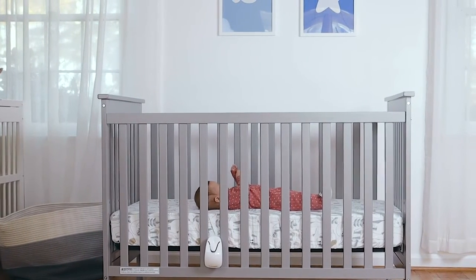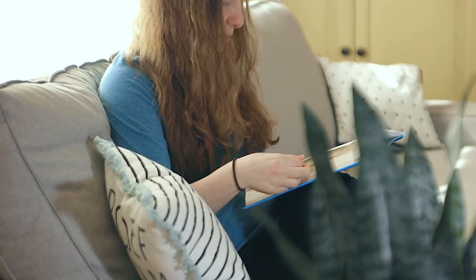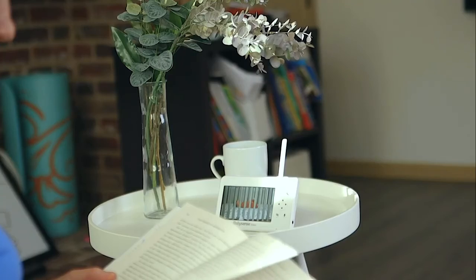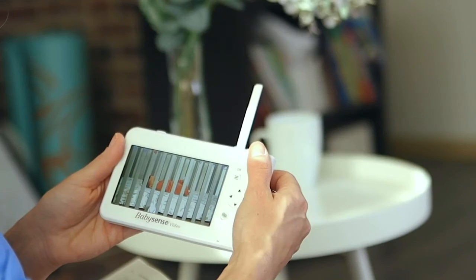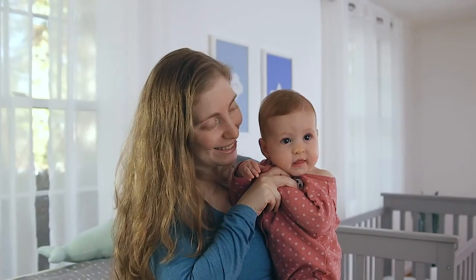BabySense 7 constantly monitors your baby's breathing movements and alerts you if movements are irregularly slow. Get true peace of mind knowing that BabySense 7 is watching over your baby, allowing you the freedom to have some time for yourself. BabySense 7 — keeping your family happy and safe.